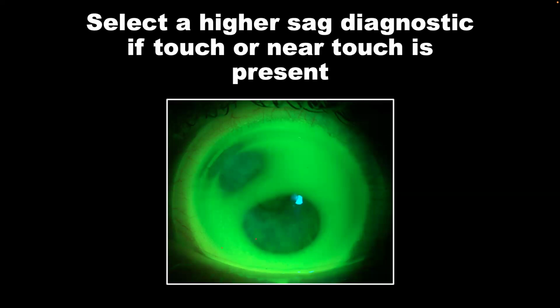We don't have to stress out when we have an asymmetric fluid reservoir, because the labs and consultants have a rule of thumb that if the separation between the apical clearance and the mid periphery is not more than 500 microns, then it's basically a good fit.